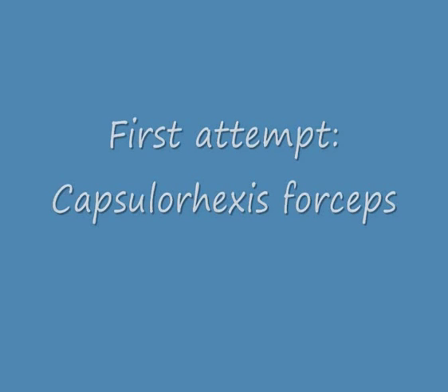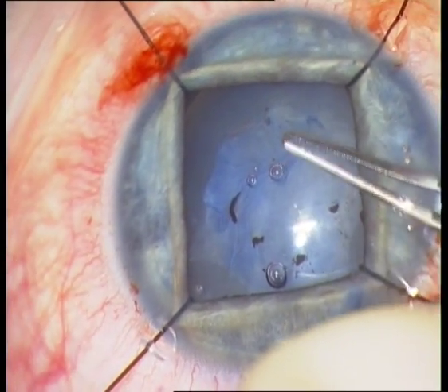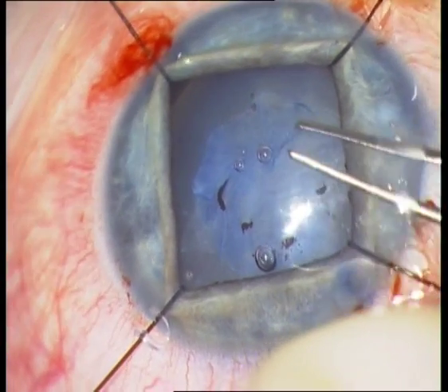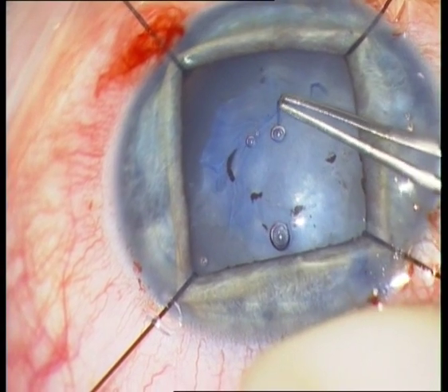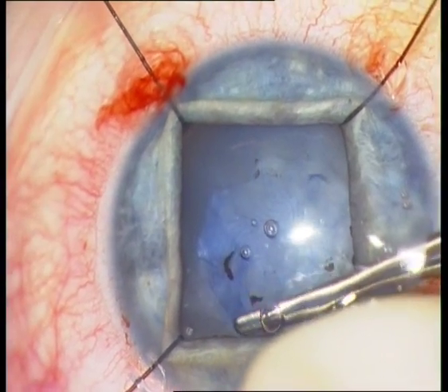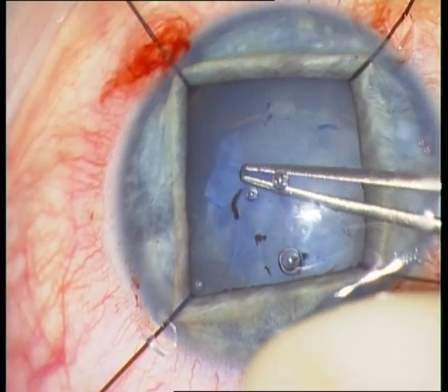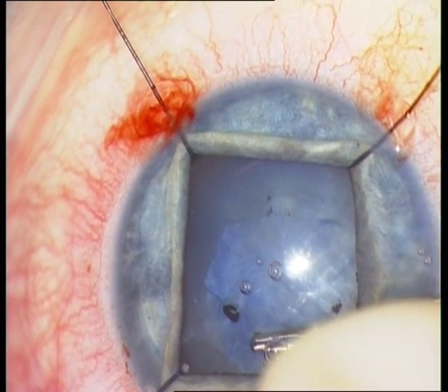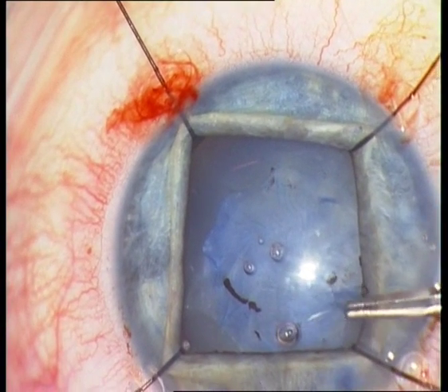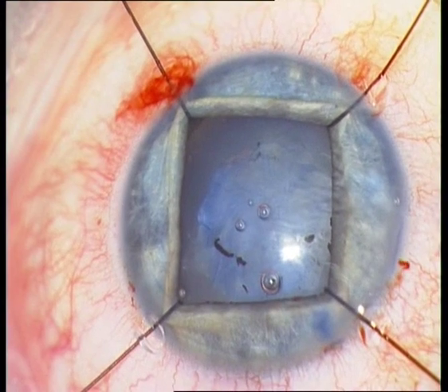I succeed partially, and I am able to remove an interior part of the anterior capsule, but the underlying part of the anterior capsule is not removable with the capsularhexis forceps.